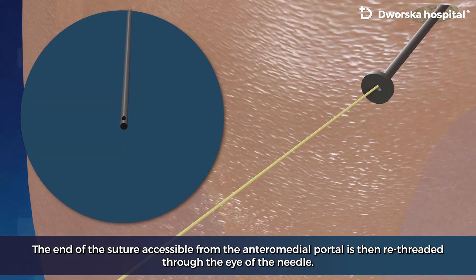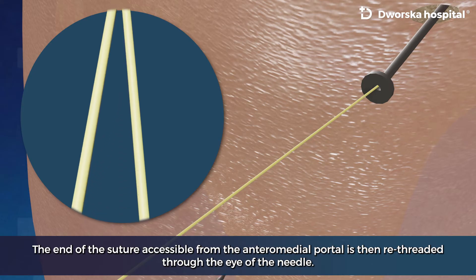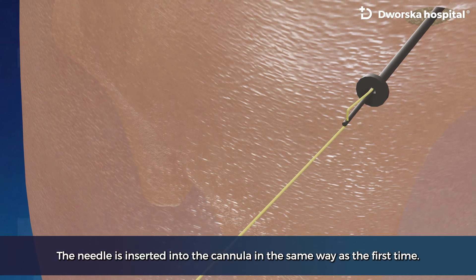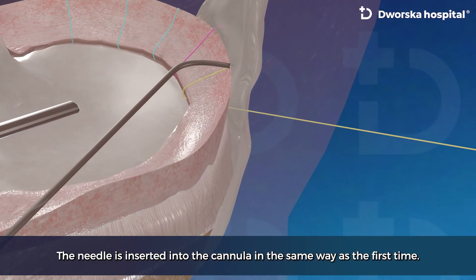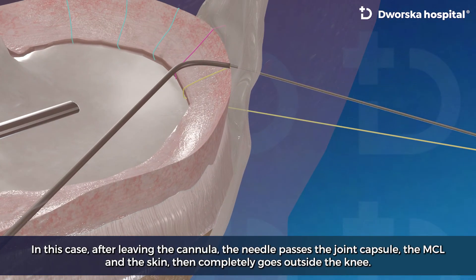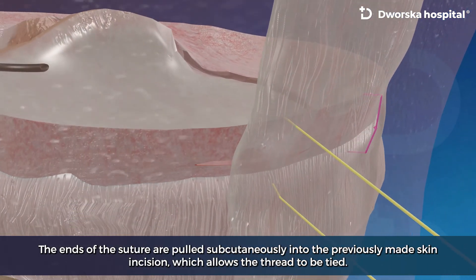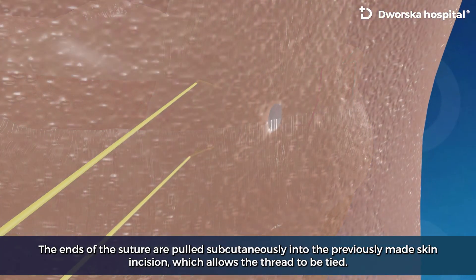The end of the suture accessible from the anteromedial portal is then re-threaded through the eye of the needle. The needle is inserted into the cannula in the same way as the first time. After leaving the cannula, the needle passes the joint capsule, the MCL and the skin, then completely goes outside the knee. The ends of the suture are pulled subcutaneously into the previously made skin incision, which allows the thread to be tightened.